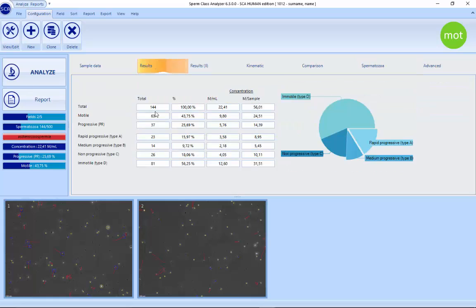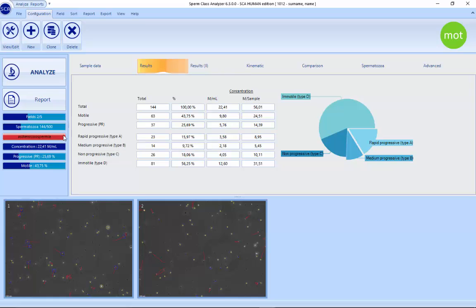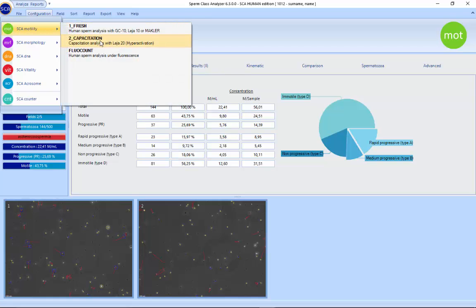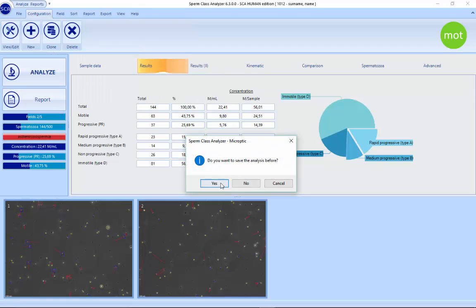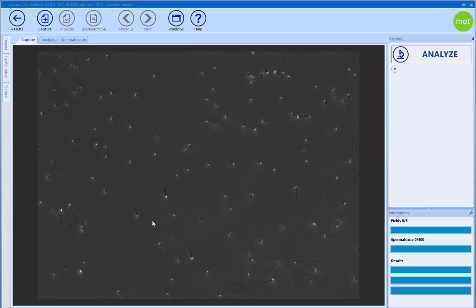Once we have the fresh motility results, the system shows a source indicator — for example 'asthenozoospermia' — and automatically explains why. It says here that the value is lower than the reference limit for progressive motility. Now we can go to the capacitation analysis.